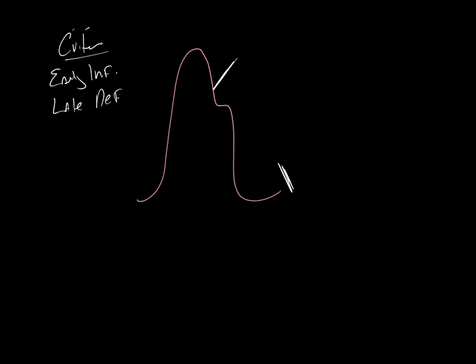Because if that balloon pump gets migrated too far up and you block the subclavian artery, you could block perfusion off to that limb, right? Likewise, you need to be monitoring perfusion of the leg where that balloon pump is inserted. And you're also going to need to splint that leg, right? Ideally put a pulse oximeter on the toe if you can, right, to monitor the perfusion.